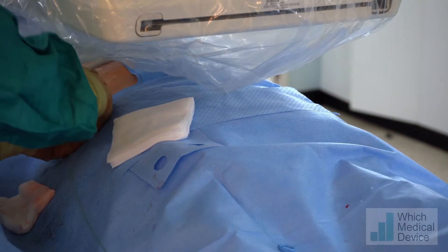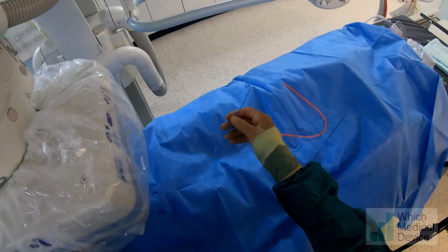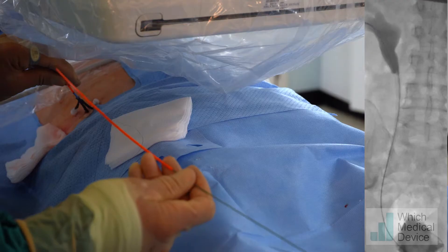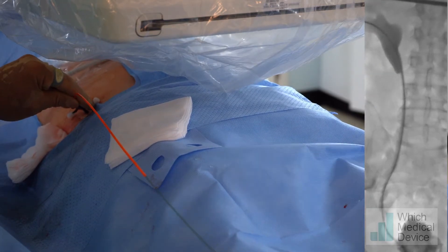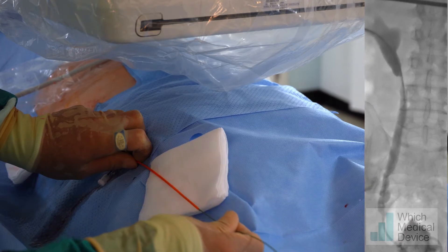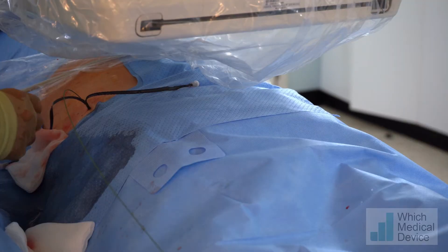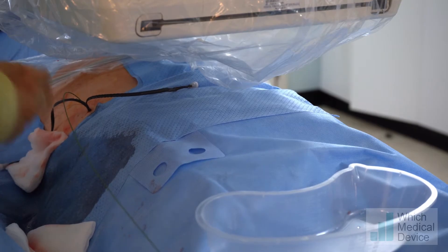First we take the inner dilator out of the peel-away sheath, then we feed the stent onto the wire and push it down into the bladder. I'm pulling the peel-away sheath back into the collecting system — you can see it just inside the calyx. I'm now pulling the wire back to allow the stent to coil, and pushing with the pusher so it coils the stent up at the top. It's important to cut the threads on the stent before you put the nephrostomy in, otherwise the threads will entangle and you won't be able to remove it.